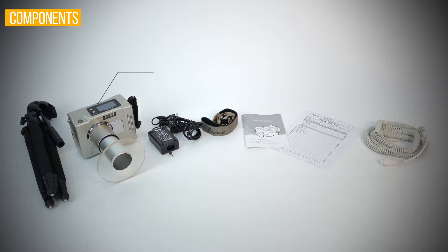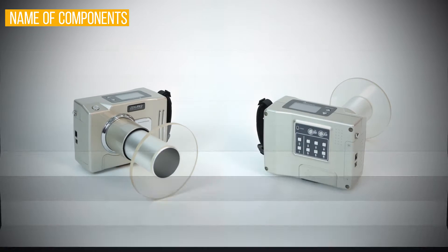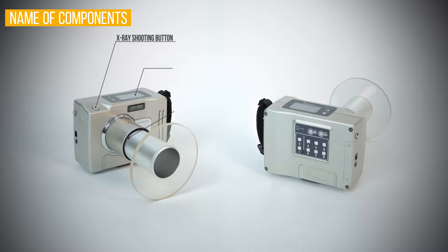Basic components: body, long cone all-in-one, charger, neck, hand switch, documents, back scatter shield, and tripod. These are the names of each component.